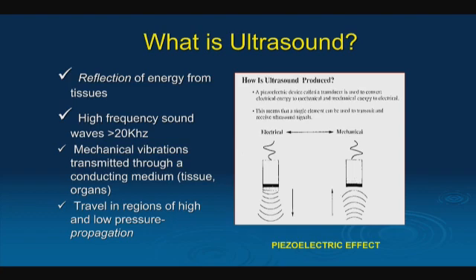The key thing is that sound waves require a medium to travel through. So sound does not travel well through air-filled structures, such as the lung and the bowel. What we typically see is that we get either a fuzzy image or we might get a black shadow that obstructs our ability to effectively see the organs that lie either adjacent to or underneath that particular air-filled structure.